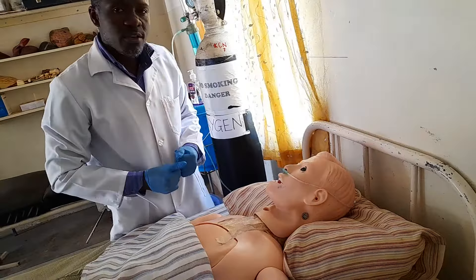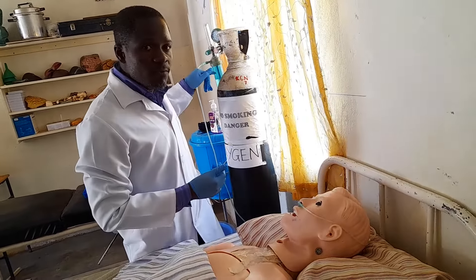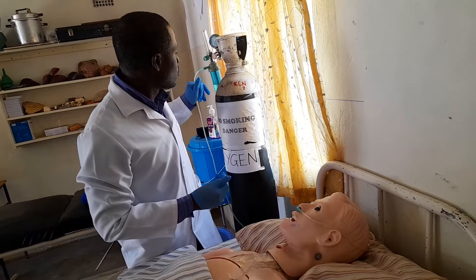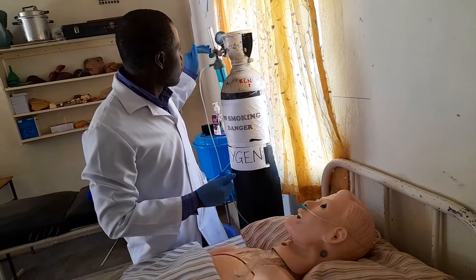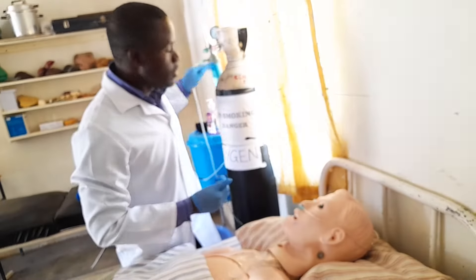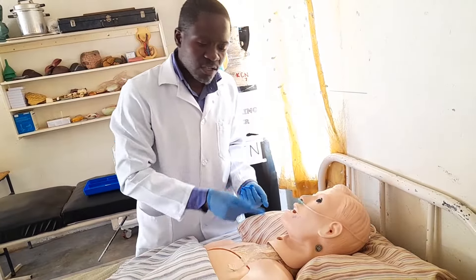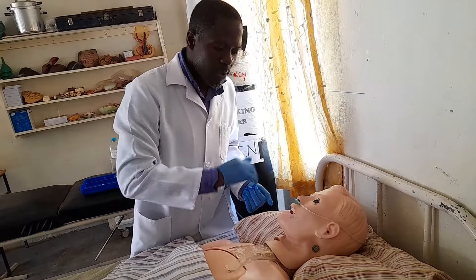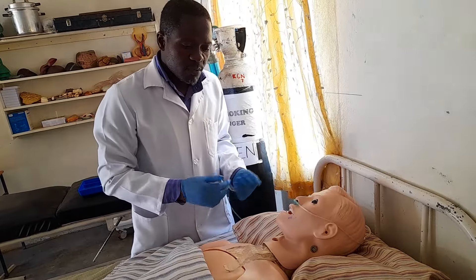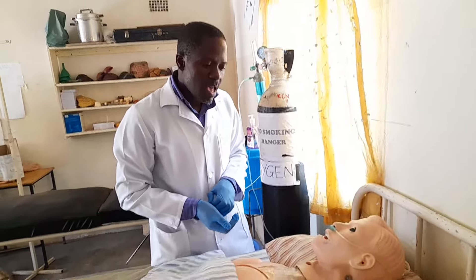You are now administering oxygen. Confirm with the flow meter that it shows five liters per minute, and there are bubbles in the humidifier — which is an assurance that oxygen is going into the patient's nostrils. This is how you administer oxygen.